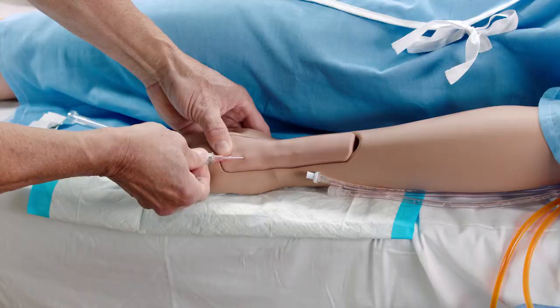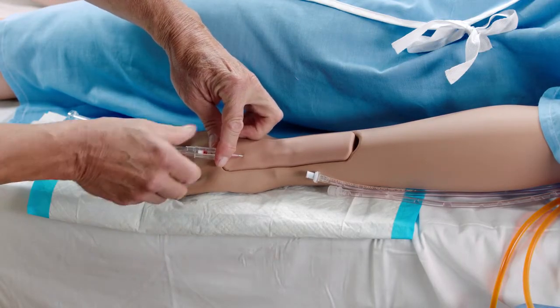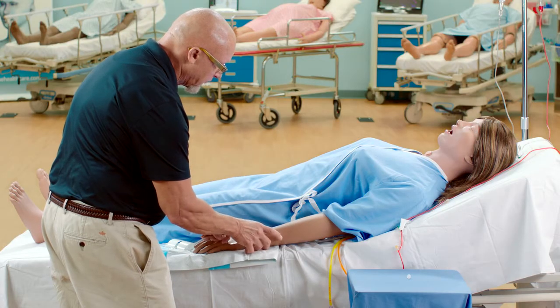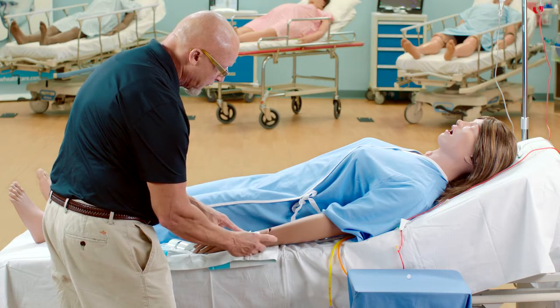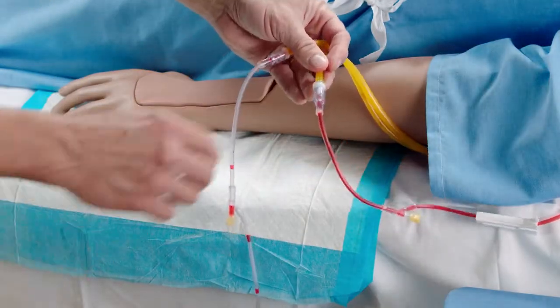Fluid and medications can be administered intravenously at the IV site. Make sure the IV drain port is connected to the IV tubing and an empty IV bag after the simulation has ended, drain the remaining fluid from the IV tubes in the left arm.